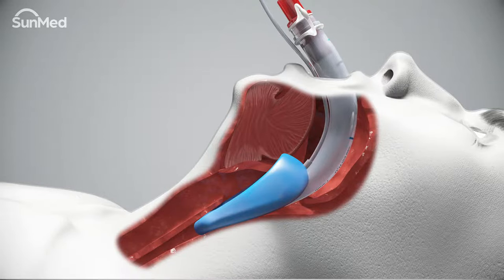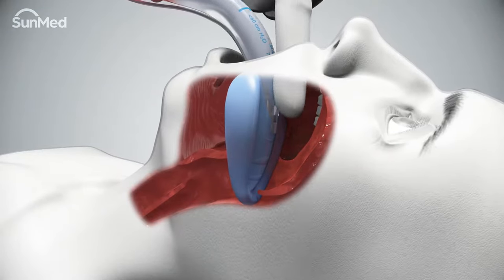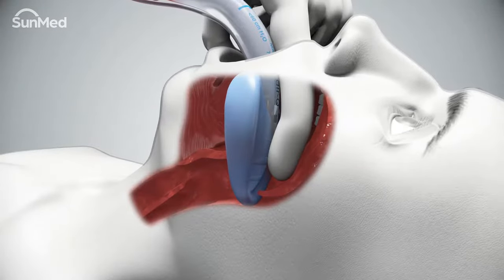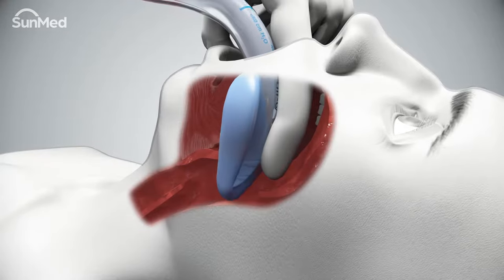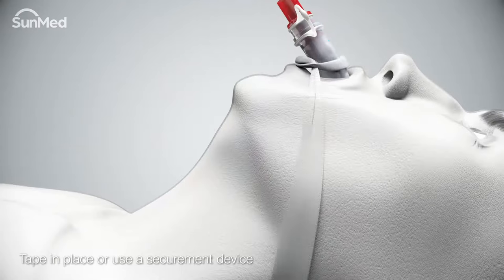Pull back slightly and reseat. Correct placement is determined by resistance to further advancement. Be sure not to over-insert the airway. An alternative method is to place the back of the left index finger behind the mask, flexing the finger forward to help guide the mask around the corner into the pharynx.